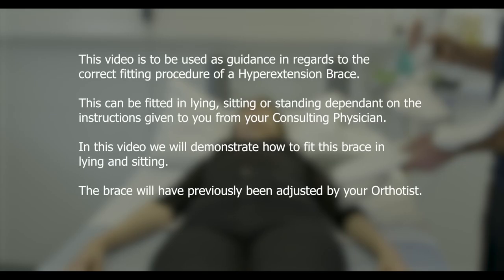This video is to be used as guidance in regards to the correct fitting procedure of a hyper extension brace. This can be fitted in lying, sitting or standing depending on the instructions given to you from your consulting physician. In this video we will demonstrate how to fit this brace in lying and sitting. The brace will have previously been adjusted by your orthotist.